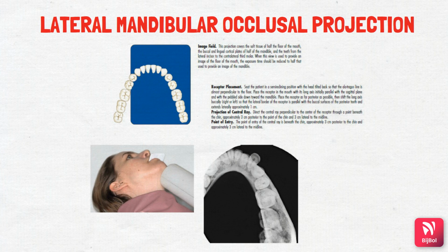With this, we come to an end on the discussions of different techniques and angulations or projections used for periapical, bite wing and the occlusal radiographs. We will see a new concept. It is called mobile imaging.